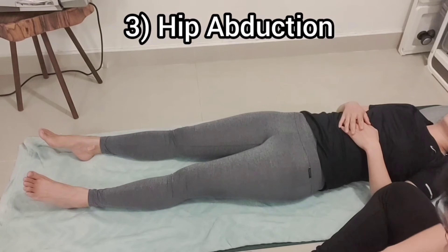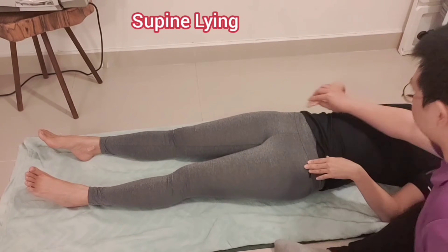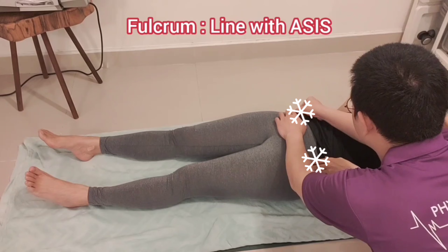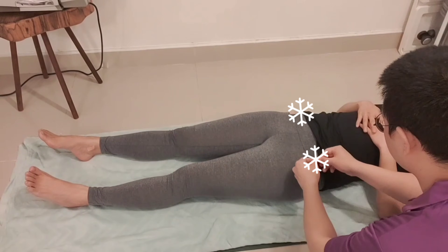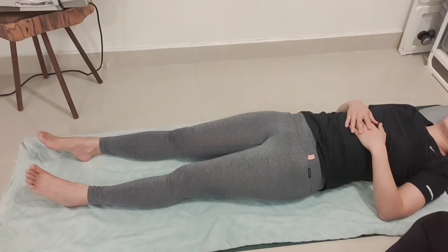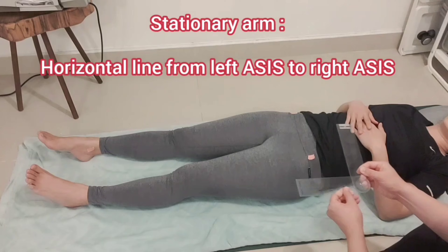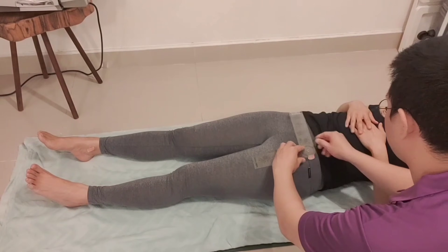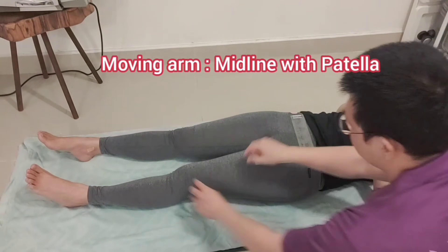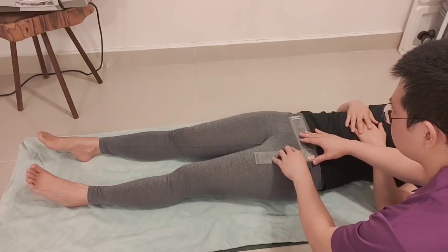Number three: the range of motion of hip abduction. Patient is in the supine lying position. Palpate the anterior superior iliac spine, put the sticker on the landmarks, and get ready for the range of motion. The stationary arm is going to be the horizontal line from the left ASIS to the right ASIS. The goniometer is set at 90 degrees, and the fulcrum is going to be the ASIS on the left side. The moving arm is aligned with the midline of the left patella, because we are measuring the left side femur.